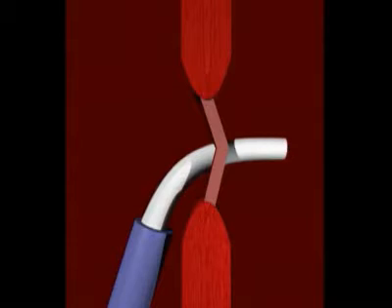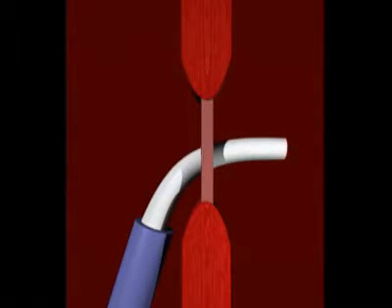So this represents an advancement then. It's definitely an advancement. And what makes this procedure safe is the fact that we are using that echo that we mentioned. Yes. The fact that we can actually see that we're in the right position in the heart, that when that needle comes out, that needle is coming out where it should come out, and not coming out where obviously it shouldn't, which can result in a lot of complications. So it definitely makes the procedure a lot safer. You know, I would say still to this day, not everyone uses the intracardiac echo technology, but it is something that we both feel is crucial to the procedure.